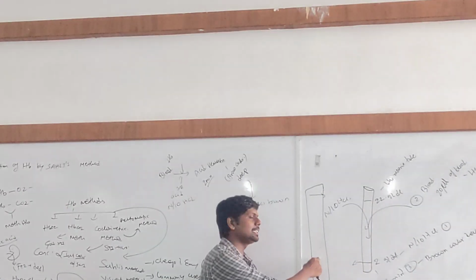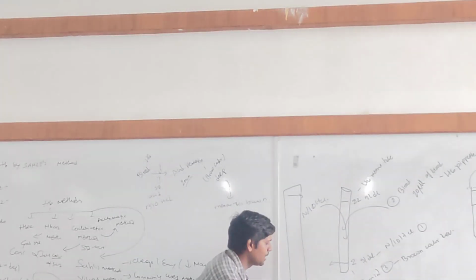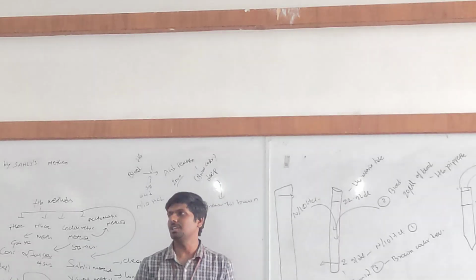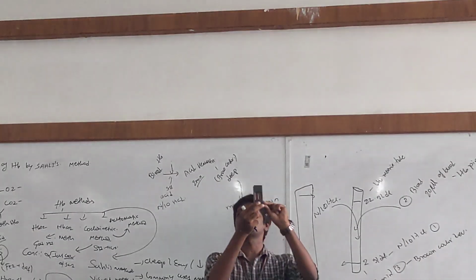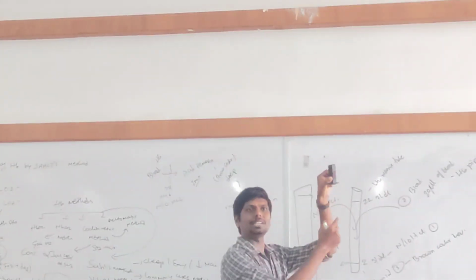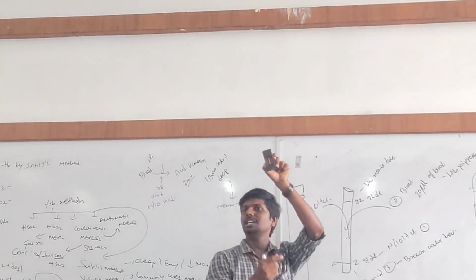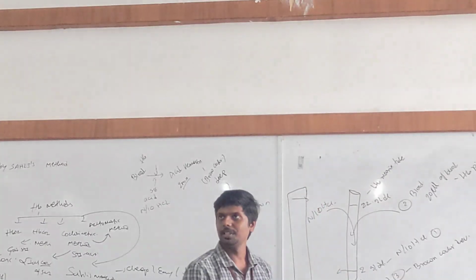You just imagine this is a comparator, for comparing. So what he did was, he kept 2 comparators in a stand like this. This is called a Sahli's stand. In this stand, can you see 2 comparators, 2 brown color rods? He already kept brown color rods, and I will tell what he did with this. Now listen.